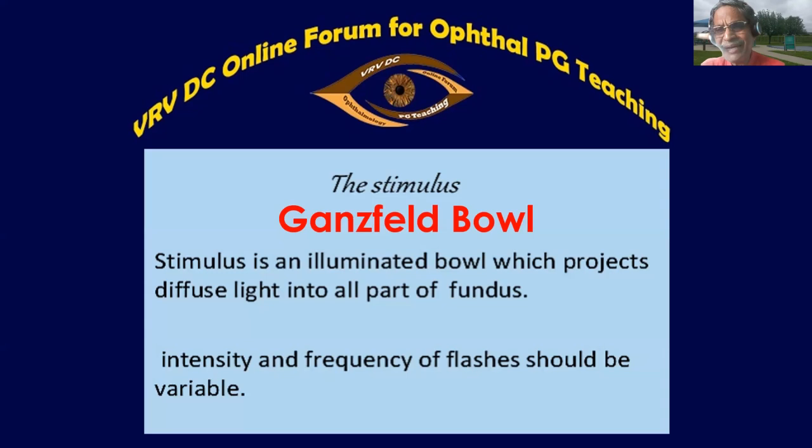Never forget, here the stimulus is a Ganzfeld bowl. This is also an exam question. The stimulus is an illuminated bowl which projects diffuse light into all parts of the fundus. The intensity and the frequency of flashes can be changed. The Ganzfeld bowl is the stimulus used for stimulating the retina in ERG.